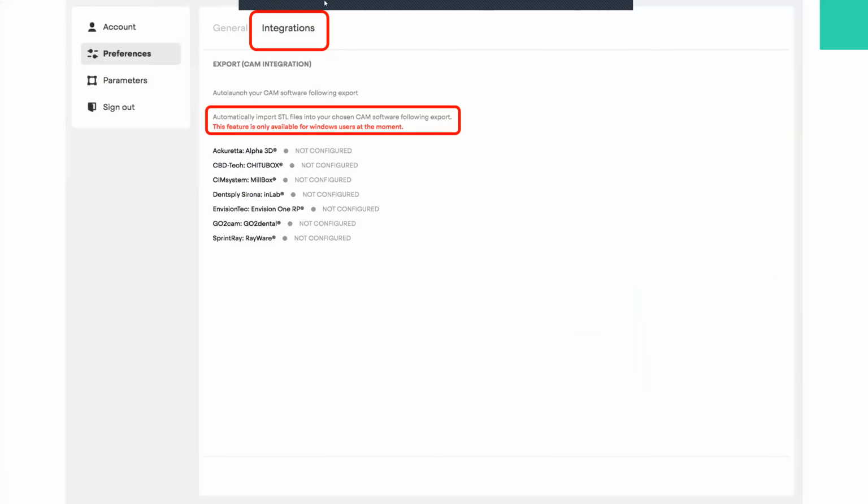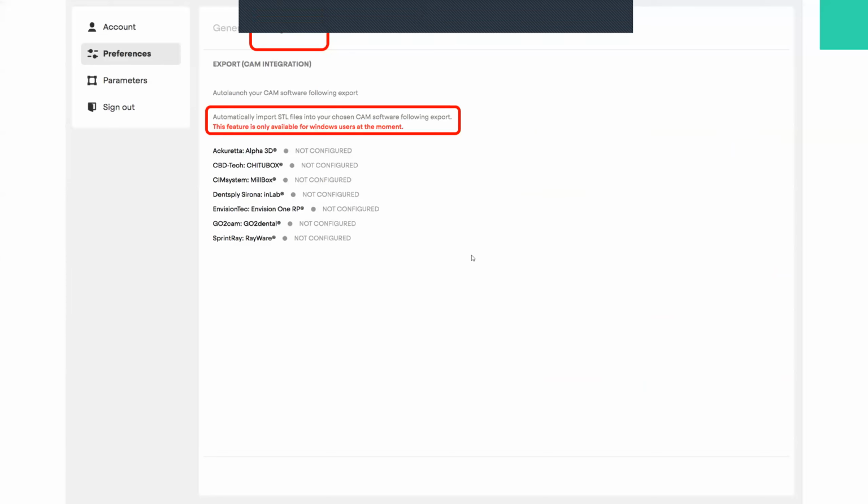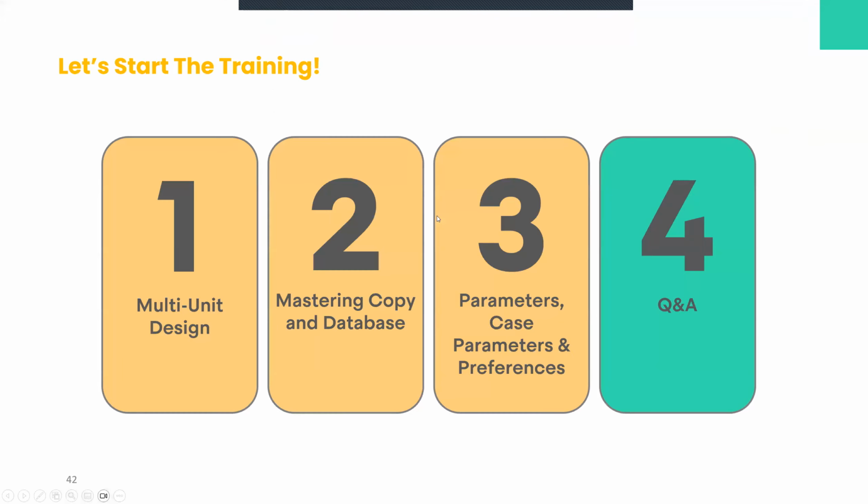Okay. Were there any questions so far? No questions, so I guess it's all clear. Let's keep going and plow through here. So that was the integrations. Yeah, we have a Q&A time now.